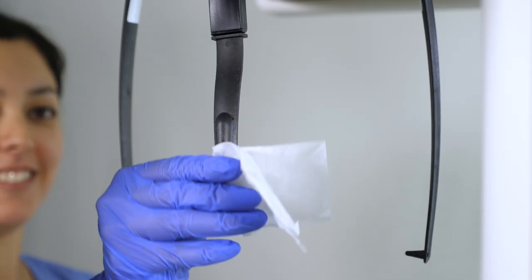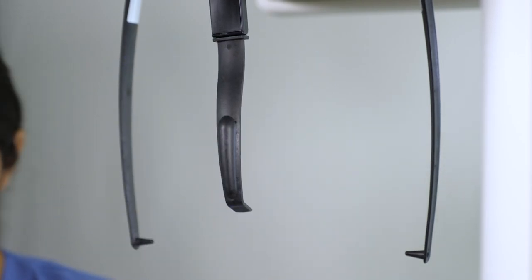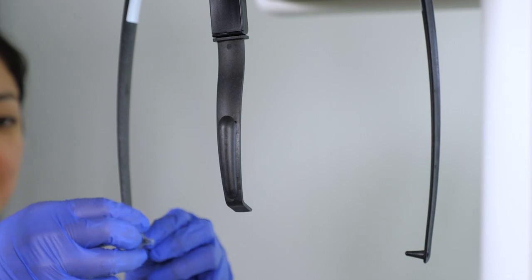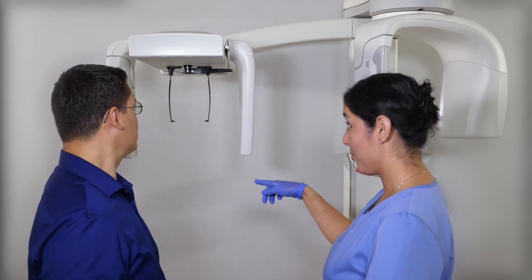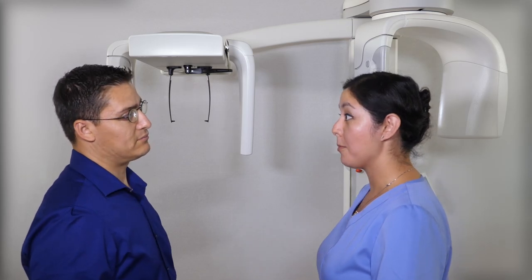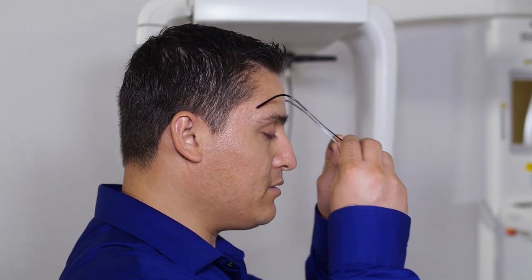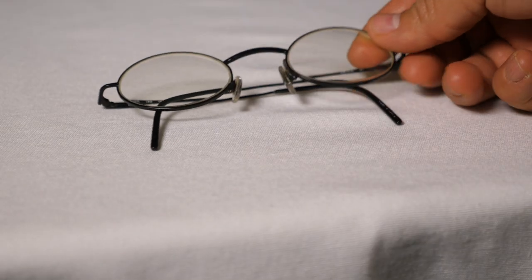Explain the examination to the patient. Use a sanitary wipe or barrier on the nasion marker and place the ear speculums on the otic posts. Explain where the patient will stand under the cephalometric attachment. Ask the patient to remove glasses and mouth or facial piercings, as well as a jacket or bulky sweater.